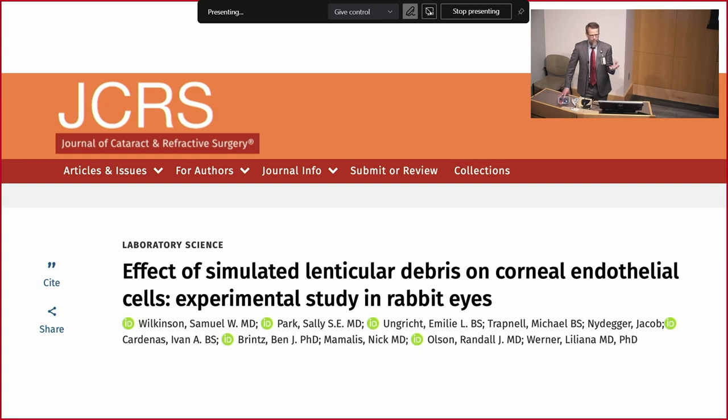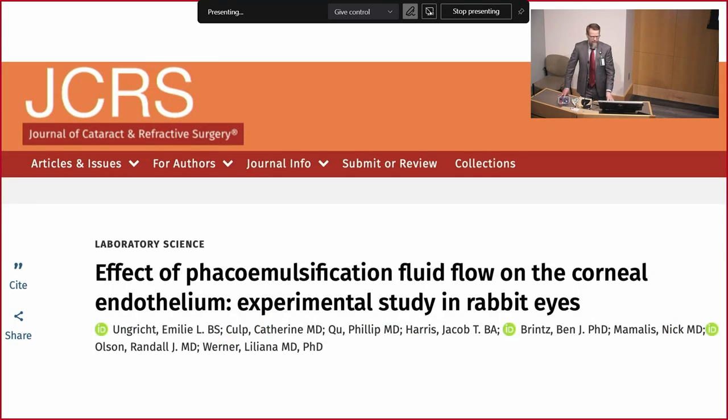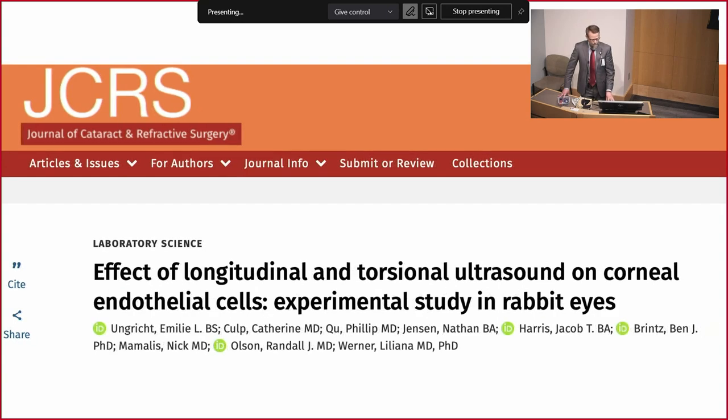And so the control group was no beads, the test group was beads, and indeed, when you did introduce beads that were circulating in the anterior chamber hitting the endothelium, as expected, but finally shown, there was a significant loss of endothelial cells. But that wasn't all. They finally had a great study on fluid flow, and the fluid flow, again, didn't actually end up being that determinative, which was really nice and helpful for us to understand the pathology of what's happening.